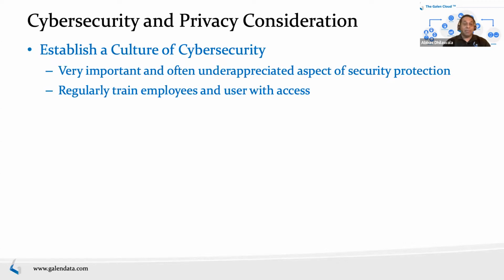But training people and making sure that everybody understands the importance of cybersecurity is a hard thing to do, and generally starts from top to bottom. But it's something that is very essential if you do care about cybersecurity in general. And then this extends, from an education perspective, to the users of the devices, right? So providers, patients maybe, and how do you enable that?